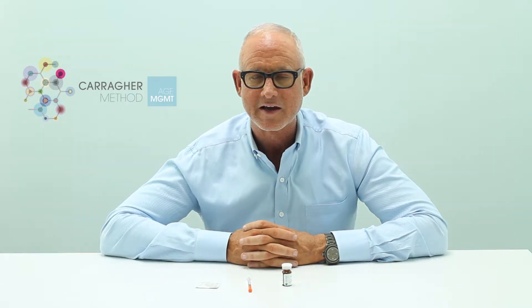Hi, I'm Dr. Mike Harriger. I'm the medical director at The Body Well, and today I'm going to instruct you on how to do a subcutaneous injection with a pre-mixed medication.